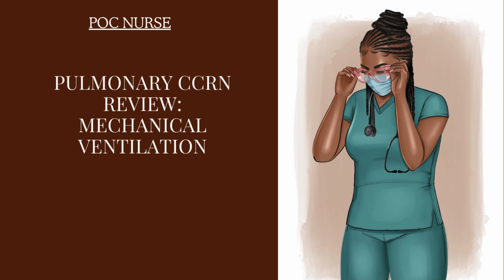Now, we're going to talk about weaning a patient from mechanical ventilation. When do we wean the patient off? Well, we wean the patient off when the original reason for them being intubated has been resolved. Let's say they had OD'd on drugs, or maybe they had surgery and were sedated during the surgery. Now they are awake, they are following commands, they are alert, they can be weaned from the ventilator.